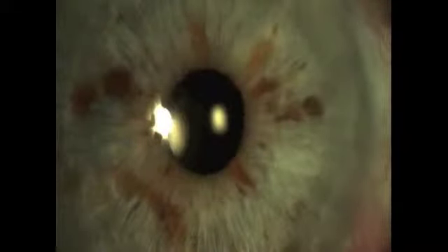Therefore, understanding on-cornea and in-cornea scars, like this is a case of on-corneal scar that followed laser scar peel followed by laser PRK to 20/20 vision. This is an in-corneal scar which underwent straight laser PRK to 20/20 vision including central clarity.